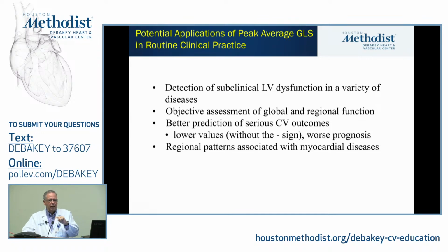And even in those days, we showed very nicely, all these parameters are affected by load, particularly afterload, but also preload. And that might explain some of the findings that we'll show later. So high afterload can lower your measurements.